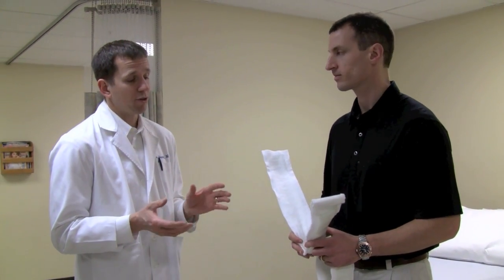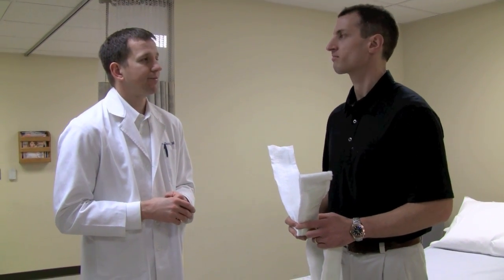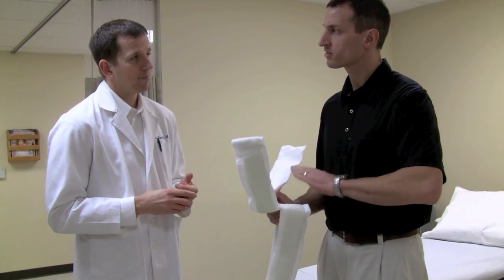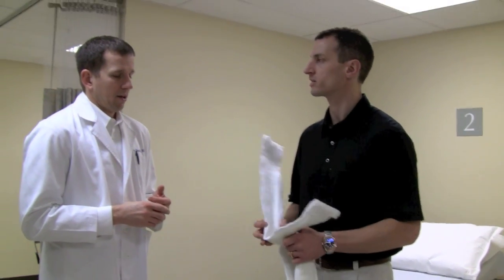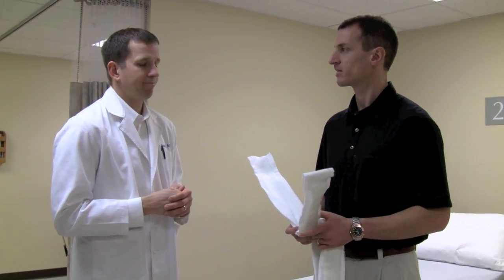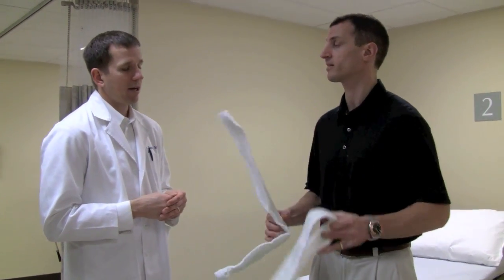Anything that's been reduced probably needs plaster as opposed to fiberglass. For the number of layers of plaster — for both the posterior and the stirrup — I like between 7 and 10, so 10 for each. It tends to be a heavy splint, but it slows them down — which is not terrible.